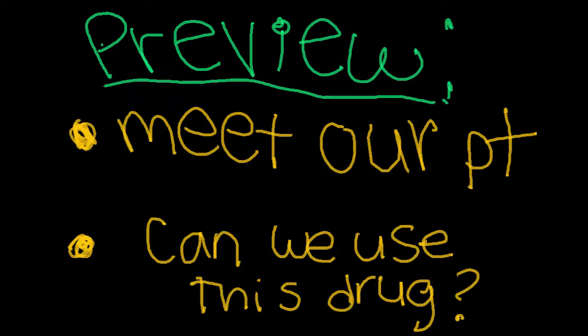Alright, so here's a little preview of what will go down in today's talk. Today we are going to be continuing our medication administration videos. The medication that we will be looking at today is oral glucose. We will meet with today's patient and then we will review when to use and when not to use this drug, and this will help us determine if oral glucose is an appropriate drug for our patient today.